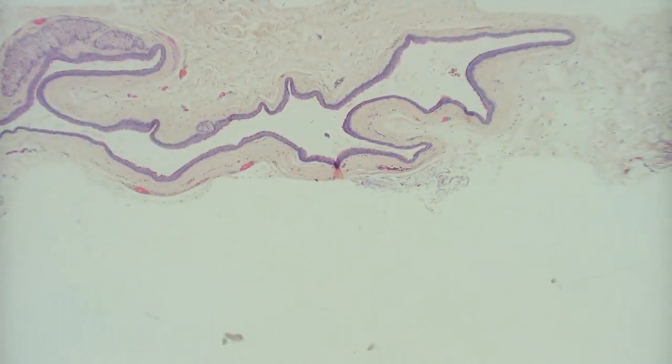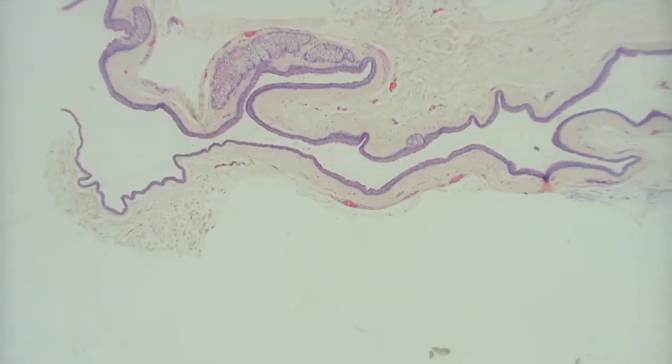Or heredity. So if it's multiple, they're often autosomal dominant. So it's often hereditary usually. Yeah, so here's what they often look like. Now if you cut into one of these, what comes out?